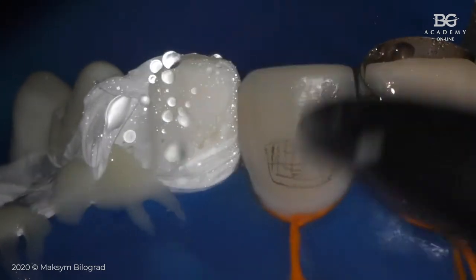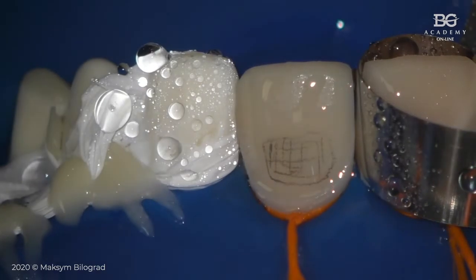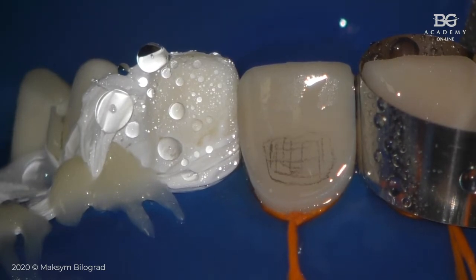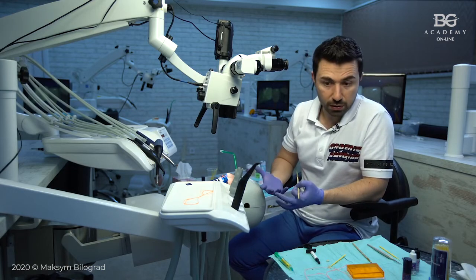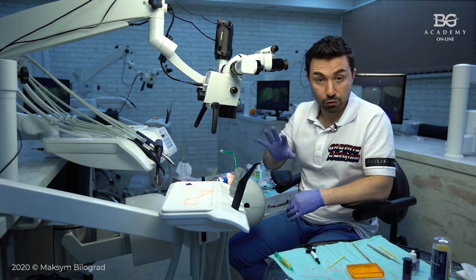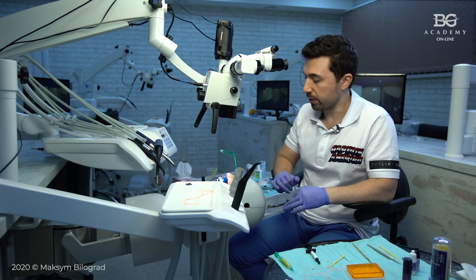So in this case, I don't know if I re-exposed my dentin or not. But if I re-expose dentin, I don't want to over-etch this area, okay? That's it. So in this case, I just work again for these 10, 12 seconds, okay?